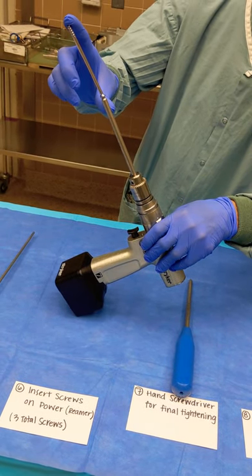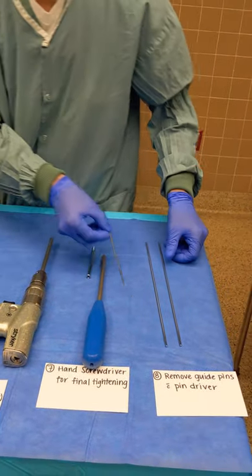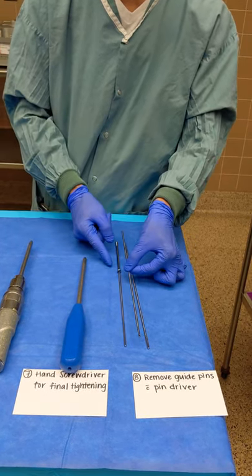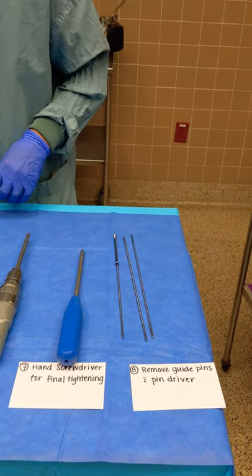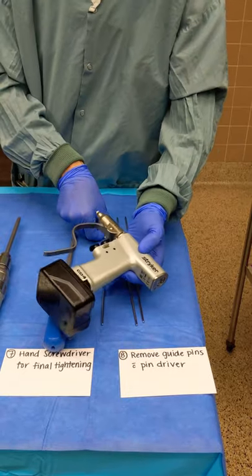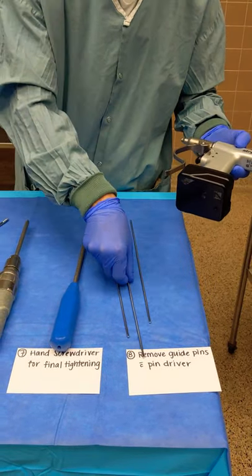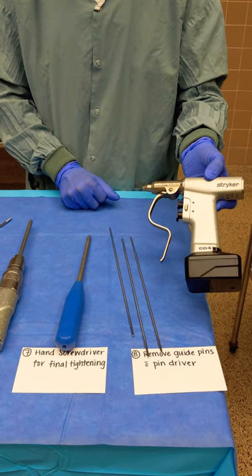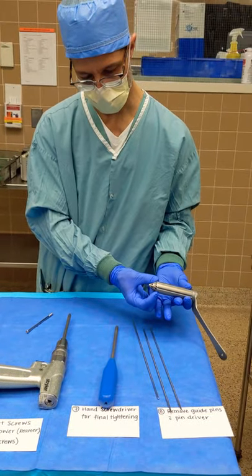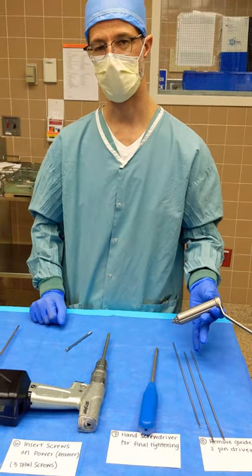They'll usually fire one pin right after another. Once all three screws are in over the guide wires, the pins need to come out. We're going to use the pin driver and pin puller to pull those guide wires out one by one. Sometimes if the bone quality is poor, they can just pull the pins out by hand and may not even request the cordless pin driver. They'll close the incision that they made — a very small incision, two stitches, perhaps some staples and a dressing — and that's all there is to it for a 6.5 hip pinning.